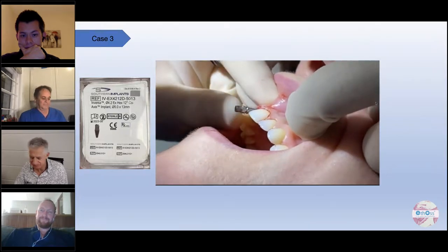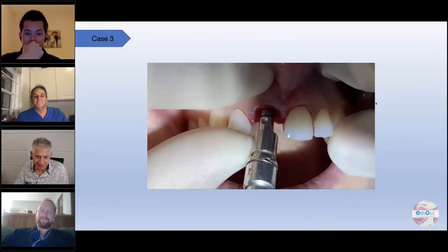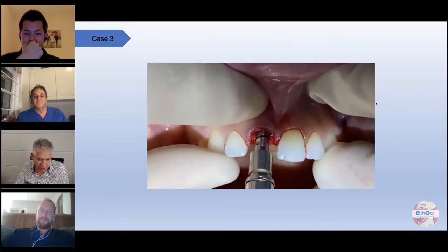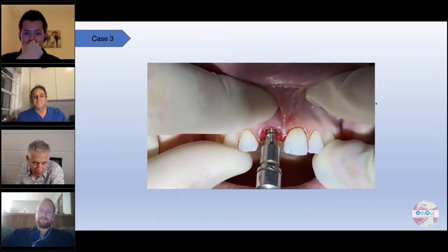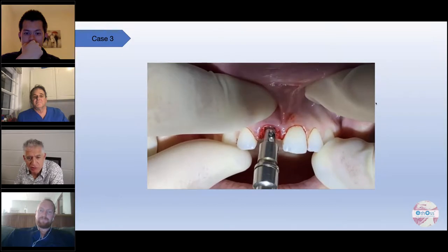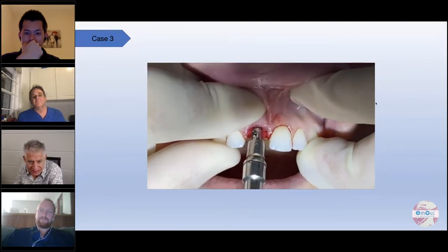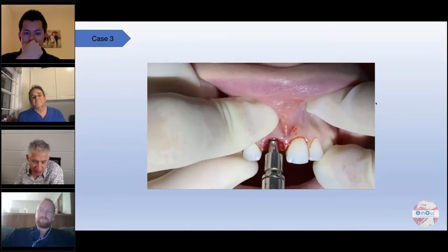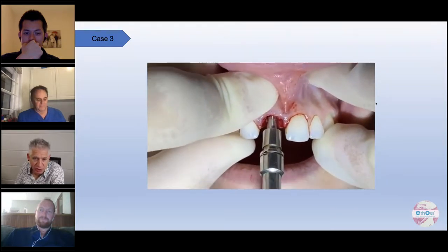So we're going to keep placing the implant because we need to make that black line that you see on the fixture mount, which is at the 3 millimeter distance from the implant, disappear. That has to disappear to allow for the biologic zone or the soft tissue, 3 to 4 millimeter required thickness, as well as space for the emergence profile.